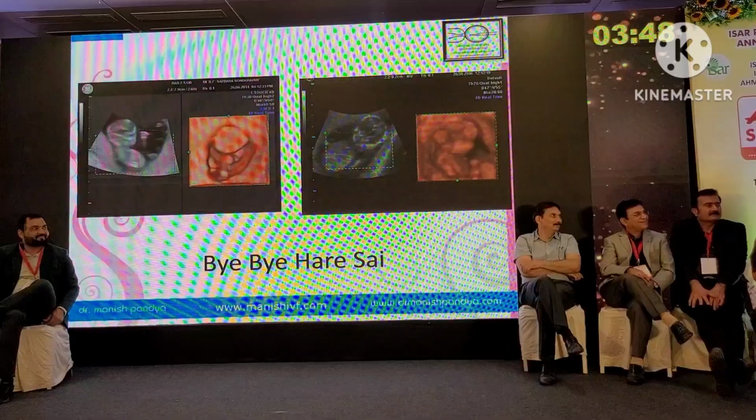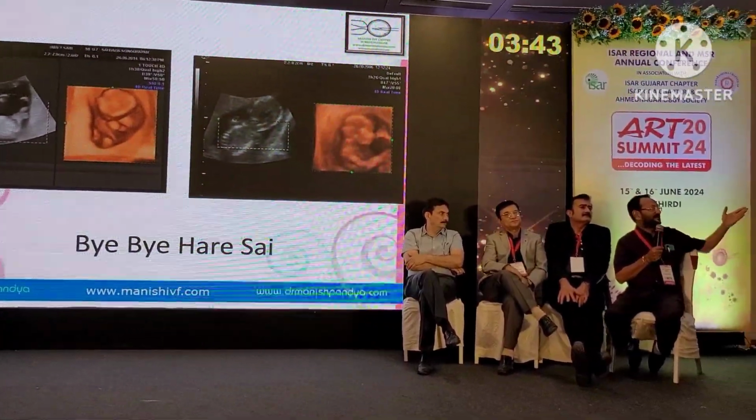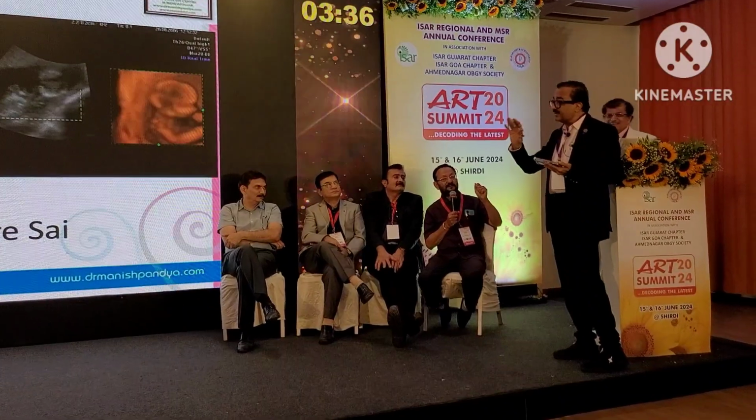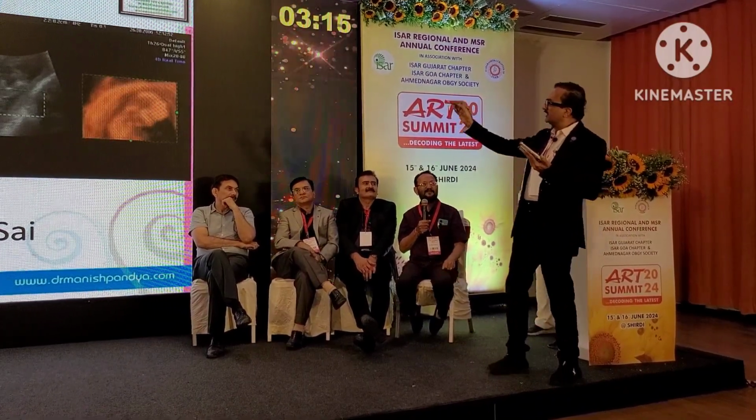One important thing, please let me tell: when we started our career in ultrasonography, Manish, and seven months before Nimish, we had only one machine and that with a linear probe. A linear probe with 7 kg weight. Yes, it was a 7 kg machine, a 7 kg probe. Remember, there is a small screen known as an oscilloscope. Yes, we had to reconstruct the image from the dots. Only one joystick was available to measure. Only two buttons were there on the machine. The size of the screen was almost 6 inch by 6 inch, a small screen.